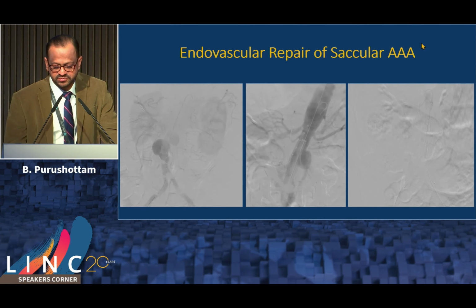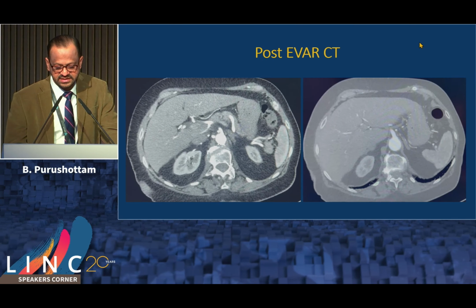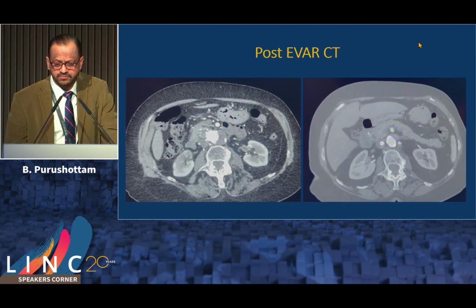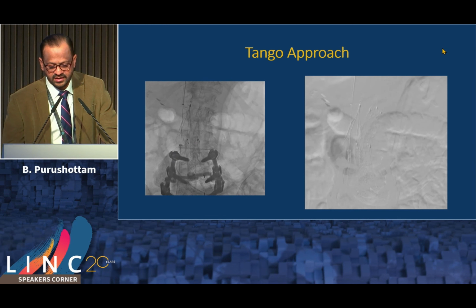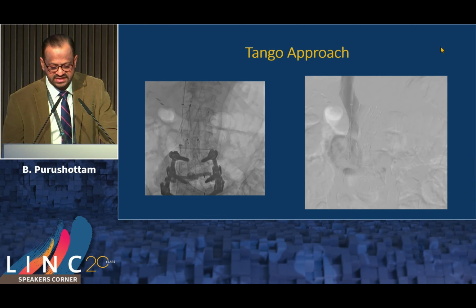The idea was to make sure we secured that, and then we did a follow-up CT to confirm that we excluded the aneurysm, and also to see where the filter was sitting in relation to all this. So we felt pretty secure. Initially we came from the top with a 9 French sheath and from below with a 12 French, and then took a picture to plan the technique.